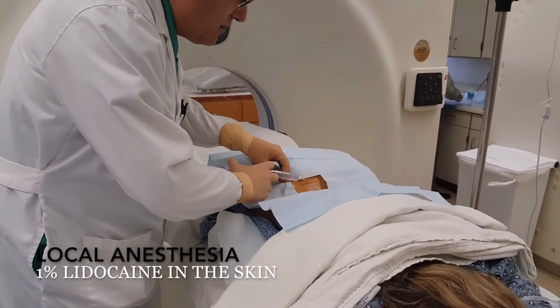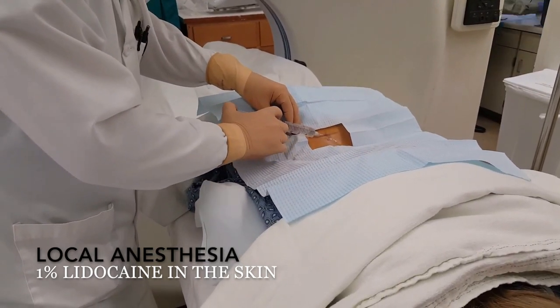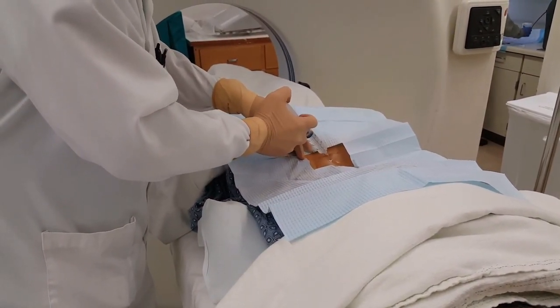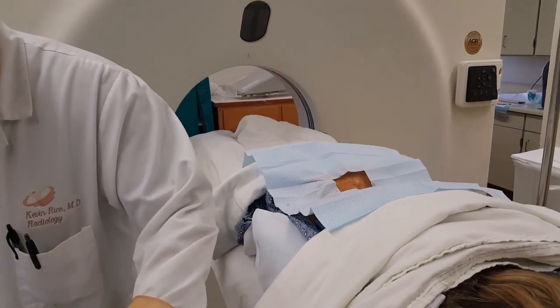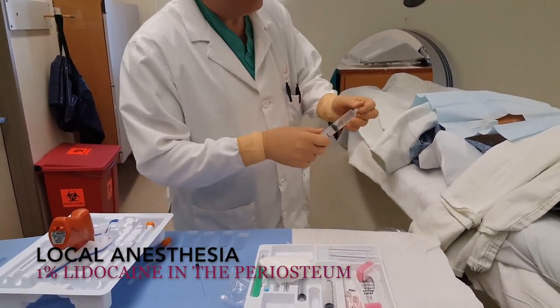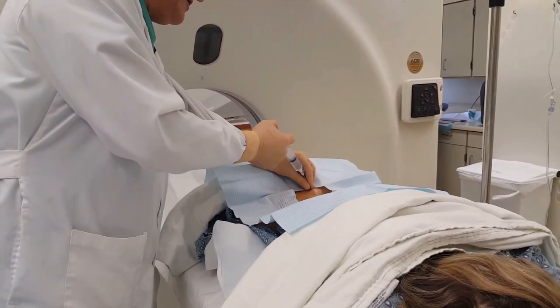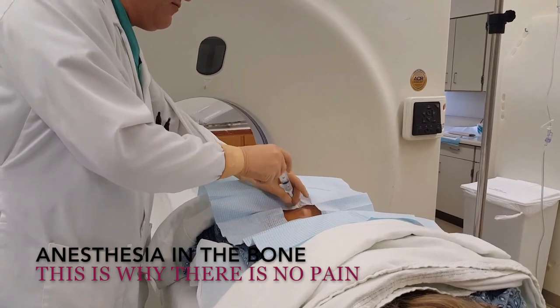1% anesthesia. You're going to feel a little needle poke here — this is the anesthesia. It might sting a bit. So that freezes the skin. Then what I do is use a spinal needle, just a little bit longer, and get to the bone. The idea here is you can't freeze the bone, but you can freeze the periosteum. So usually you're okay with 10 ml of 1% lidocaine.